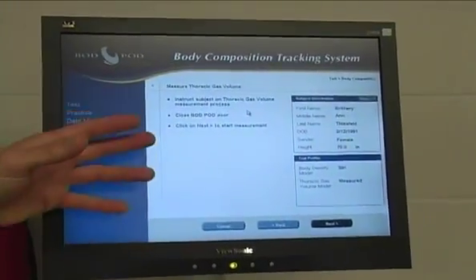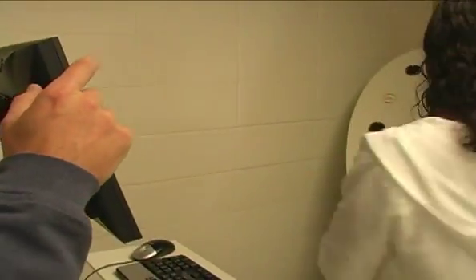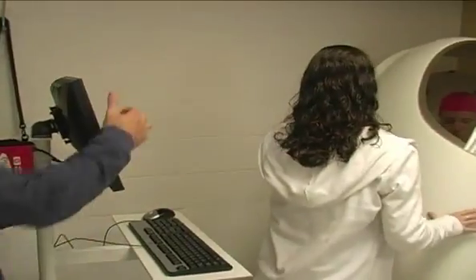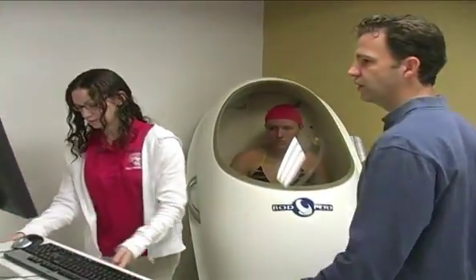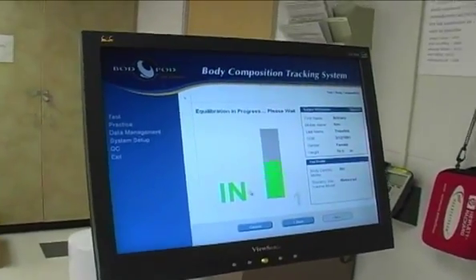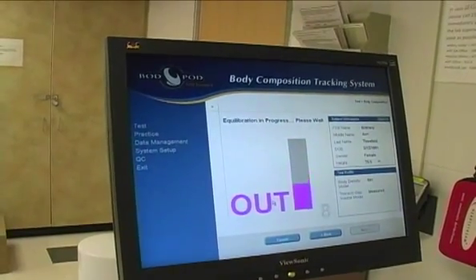Okay, so we instructed her. Now, let's move this over so she can see it. And close the door, and then, if you can see it, give me a thumbs up, okay? If you can see this. Can you see it? Okay. So, you're going to click next to start the measurement. And not yet, so it's just, that's the cadence that I was talking about, that's in and out. It will tell her to put tube in the mouth.